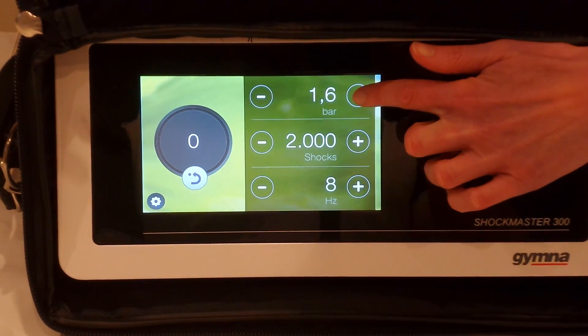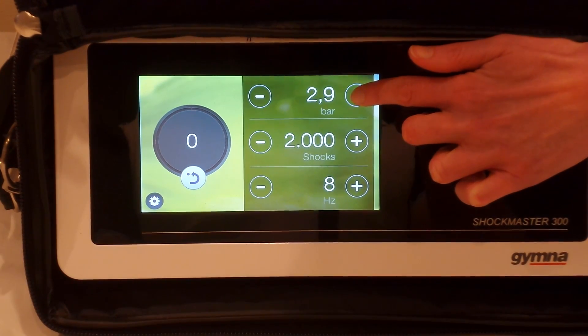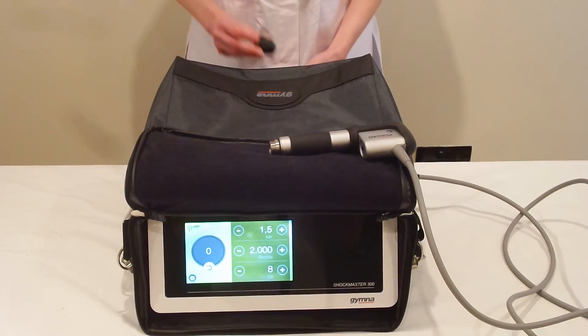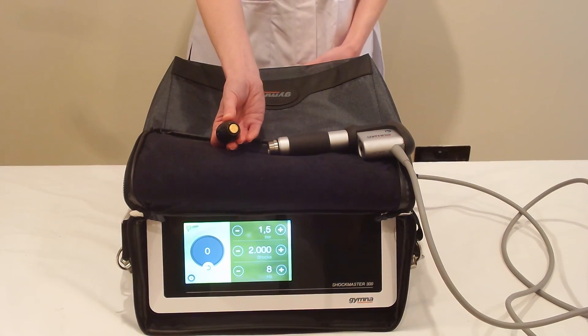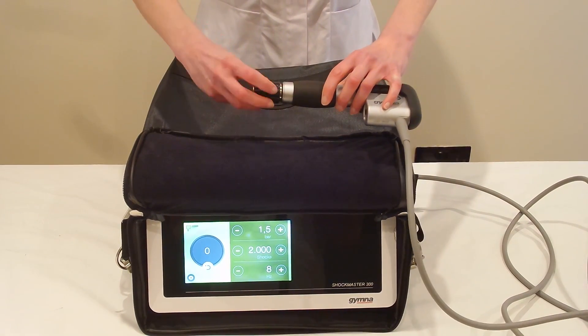This treatment is for tendinopathy at the origin of the hamstring tendons. We're going to take the power up to 3 bar and the hertz up to 10 hertz. We're doing 2,000 shocks and we're going to use a focused head — in this case a 15 millimeter convex head.